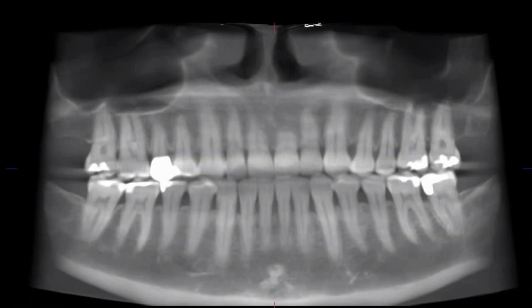Now, the patient also tells me during the clinical exam towards the end of it, oh, by the way, I'm also finishing up treatment with one of these DIY aligner companies. And the main reason I'm here, as I mentioned, is my bite just doesn't feel right. Like, it just doesn't feel right. And I'm looking at her occlusion. I'm saying, well, your occlusion's not bad.